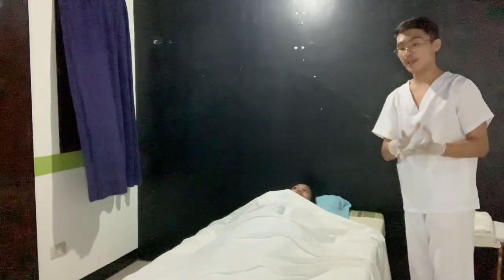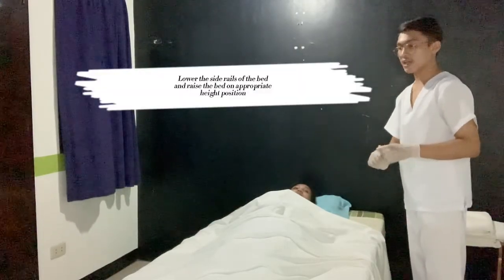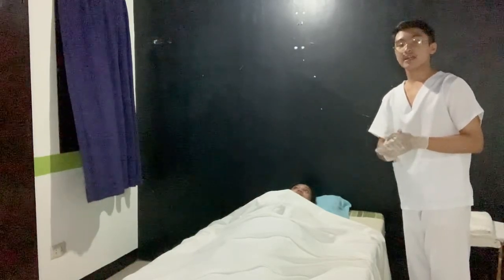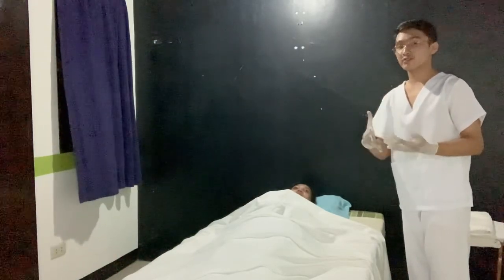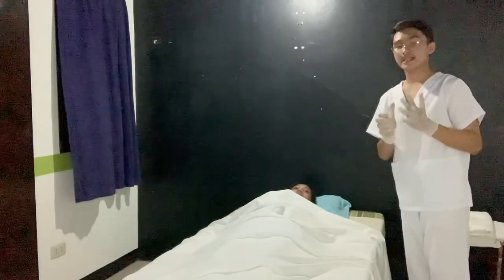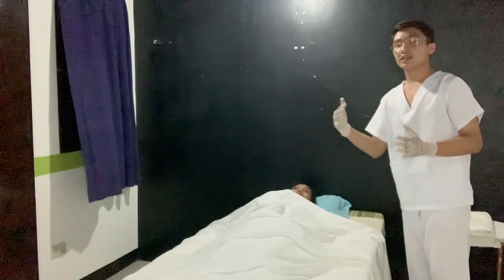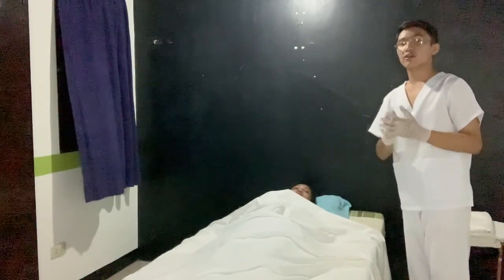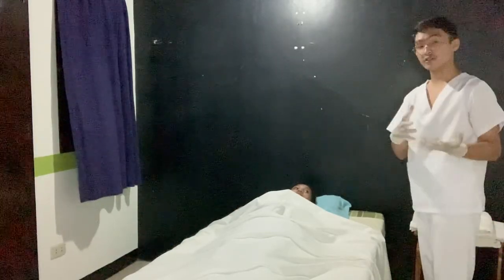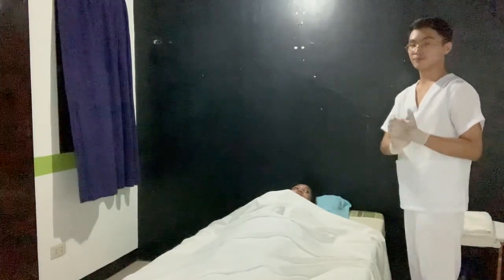So before we make the procedure in bed making, we need to make sure that we raise the bed to the appropriate height position. It helps to prevent some muscle strain and injuries to the health provider. Likewise, we need to lower the side rails of the bed, leaving the opposite side up to prevent some accident or injuries to the patient. And of course, don't forget to lock all the wheels to prevent some accident as well.